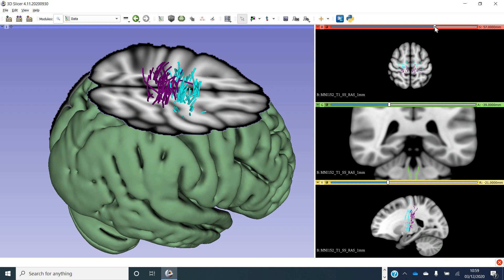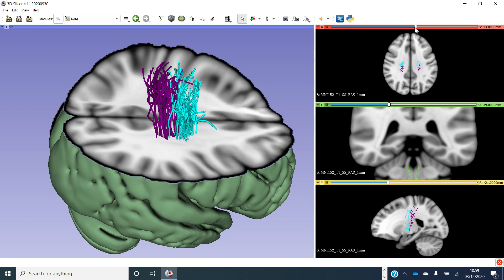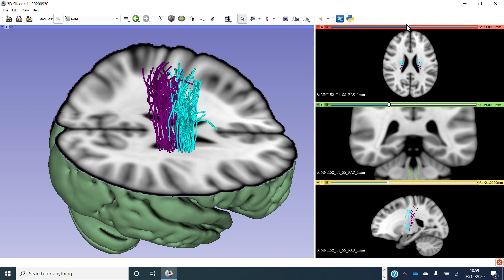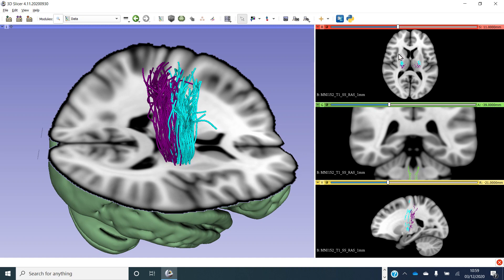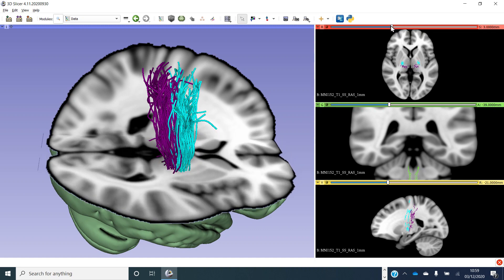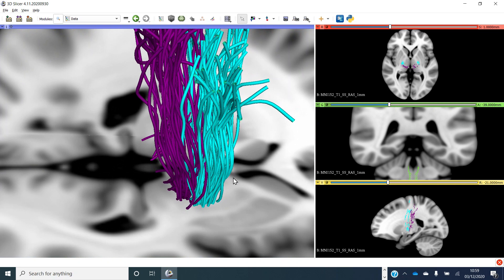Let's now slice down through the brain until we get to about the level of the thalamus, passing down through the internal capsule. We can see quite nicely in the transverse section the V-shape of the internal capsule, with the blue motor fibres running in the posterior limb. We can also start to see that the purple third-order sensory fibres have originated in the thalamus. Here is the internal capsule with its V-shape, and this grey matter here is the thalamus, which is of course the origin of these third-order thalamocortical sensory fibres.